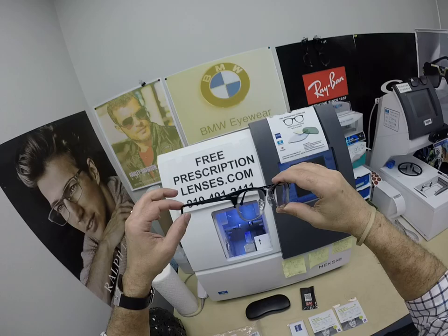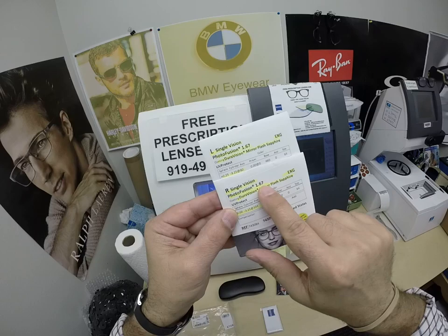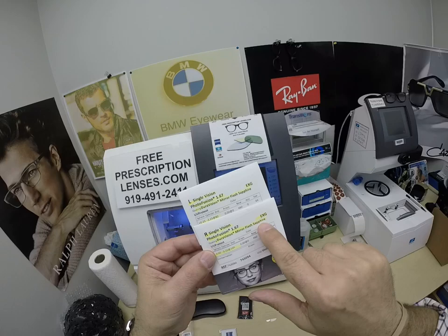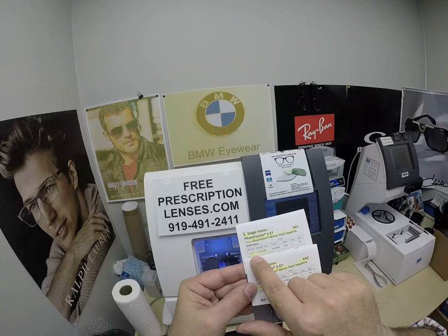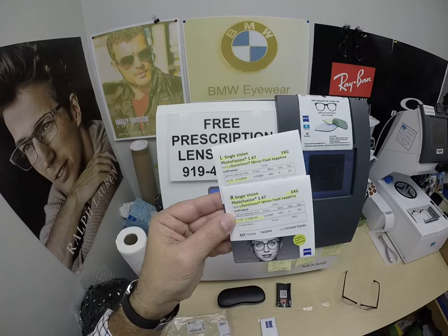More currently, the Photofusion lenses. Mark got the Zeiss single vision 1.67 high index, Photofusion Extra Gray, the Duravision mirror flash sapphire. I like calling it the blue sapphire flash mirror. The prescription for the right eye is highlighted: plano, minus three and a quarter. Same for the left: plus a quarter, minus three and a quarter.